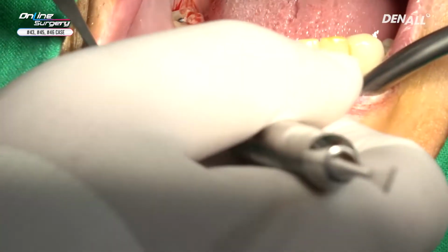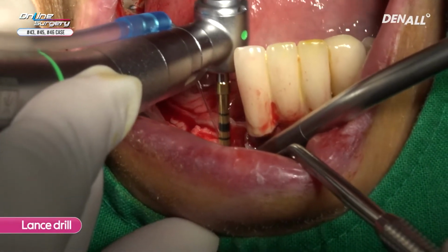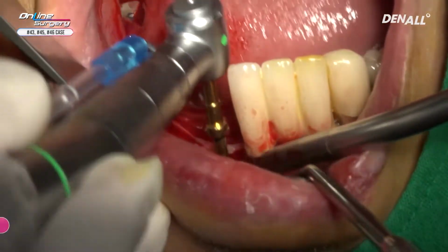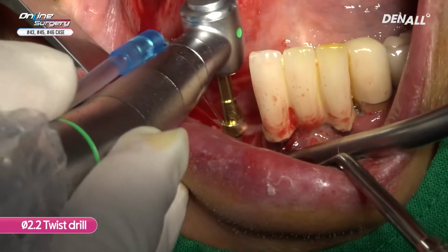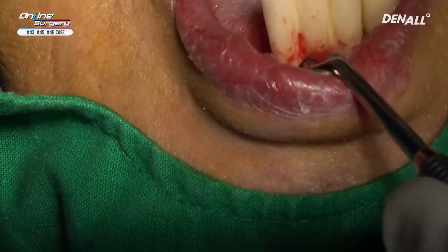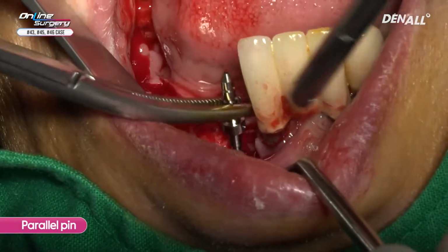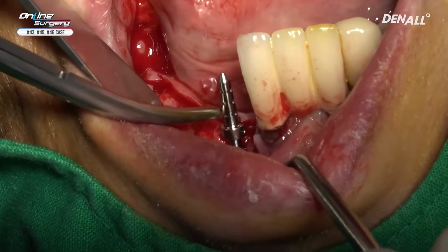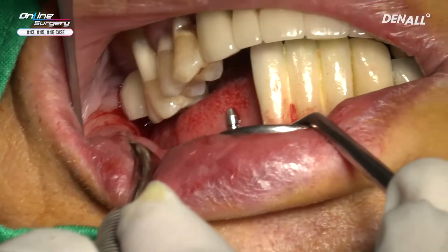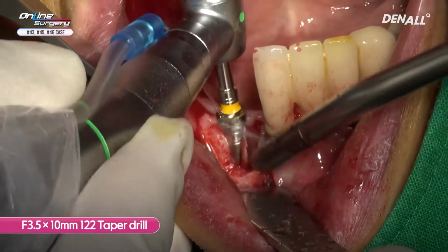Are you in pain? Don't swallow. Try to bite on your molars. Say ah. Don't move.